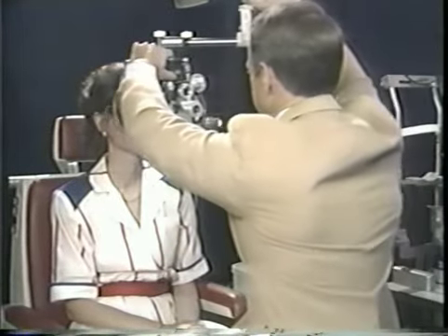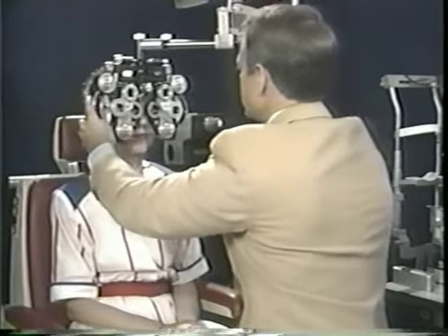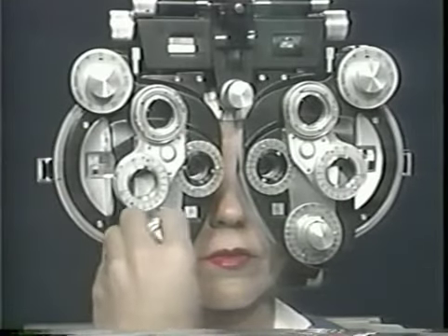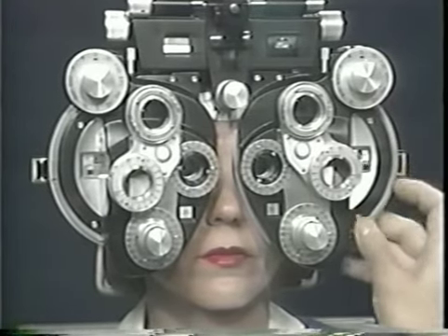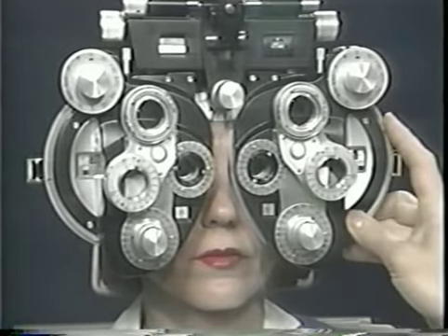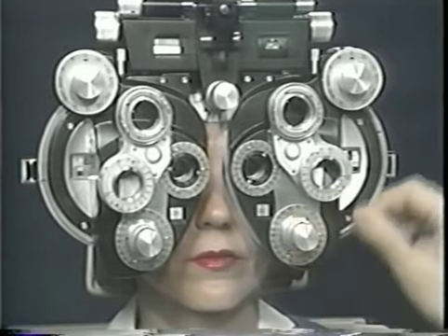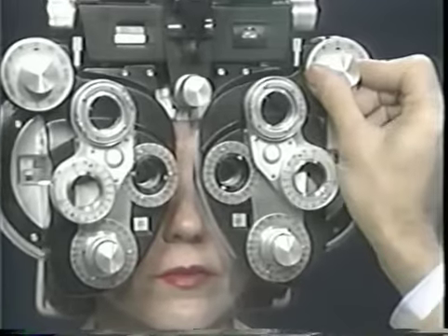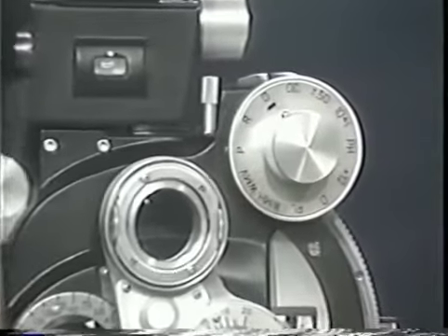It is usually faster to refine an existing refraction than to start from zero power, so whenever possible, start with the previous correction or with the retinoscopic finding. Most refractionists occlude the eye not being refracted, but some leave it open, blurred by plus lenses. Here, Dr. Guyton begins by occluding the left eye and taking an initial visual acuity for the right eye.